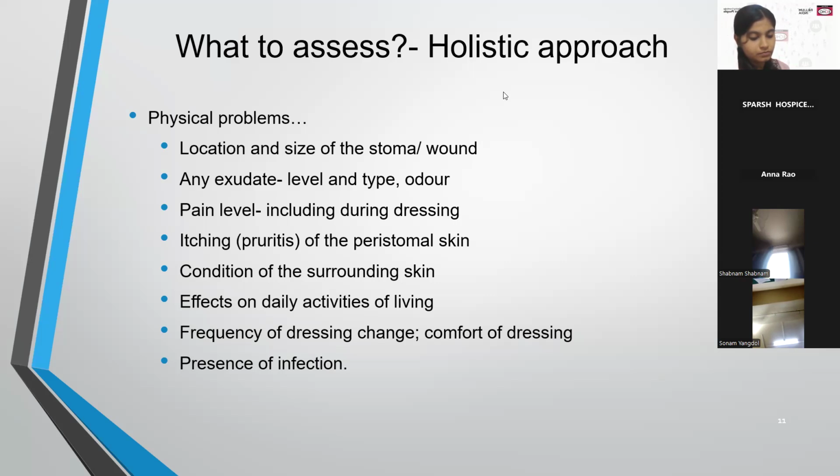Then identify what the pain level is. Do a thorough assessment. All of you know how to do pain assessment. Depending on that, you have to identify the level, including during dressing also, because our patients will require dressing, even in the stoma. They may have to change bags, so see whether the patient is having any kind of pain because of the stretching of the skin, and the surrounding condition of the skin.